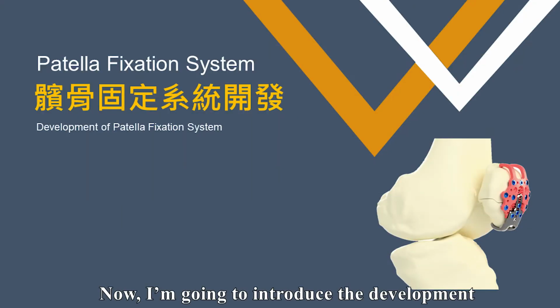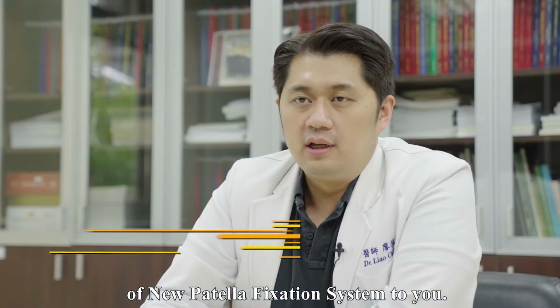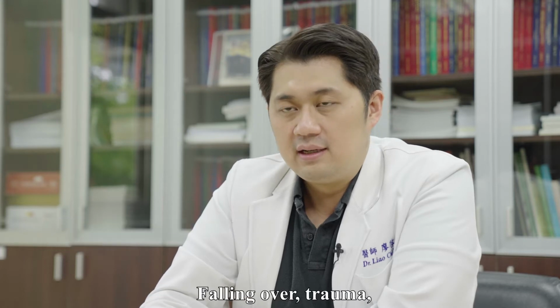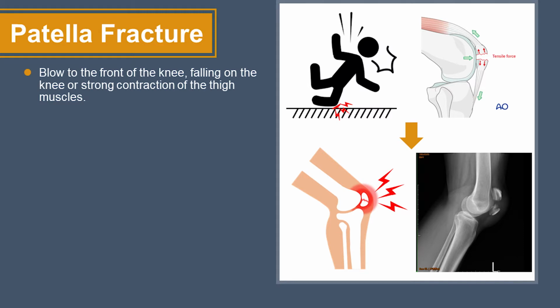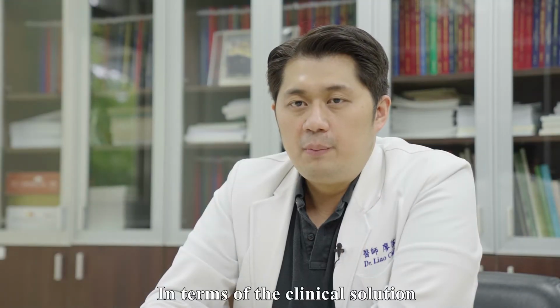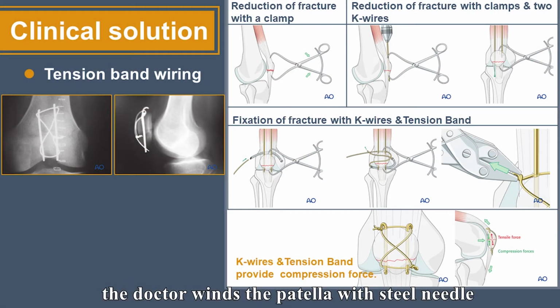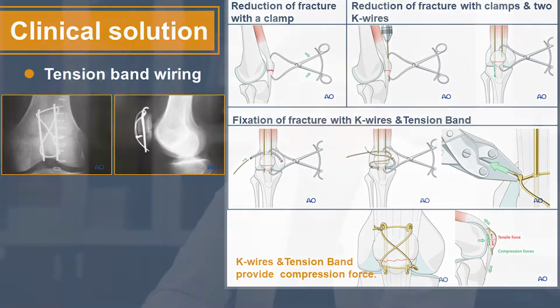Now, I'm going to introduce the development of the new patella fixation system to you. The patella is a piece of bone in the human knee. Falling over, trauma, or a car accident can cause patella fracture. When the knee is painful and unable to reach full extension, the patient will need surgery. In terms of the clinical solution in Taiwan nowadays, the doctor winds the patella with steel needle and steel wire so as to perform the fracture reduction.